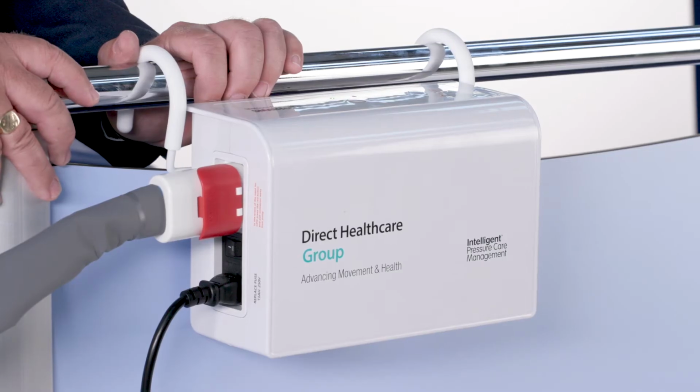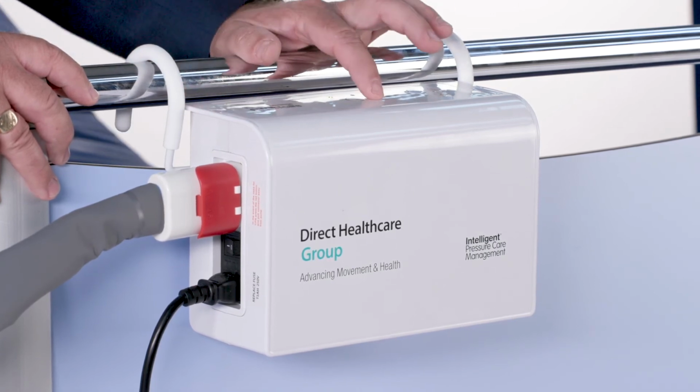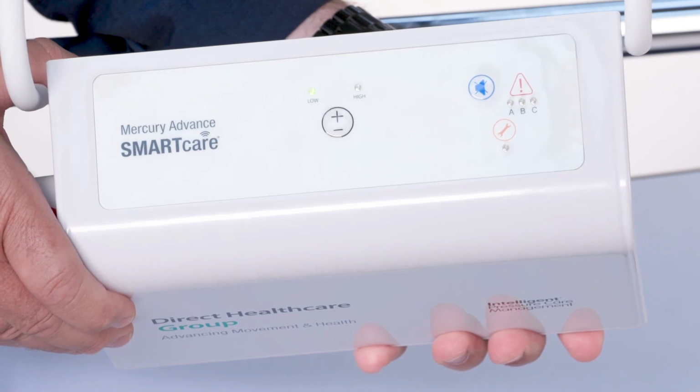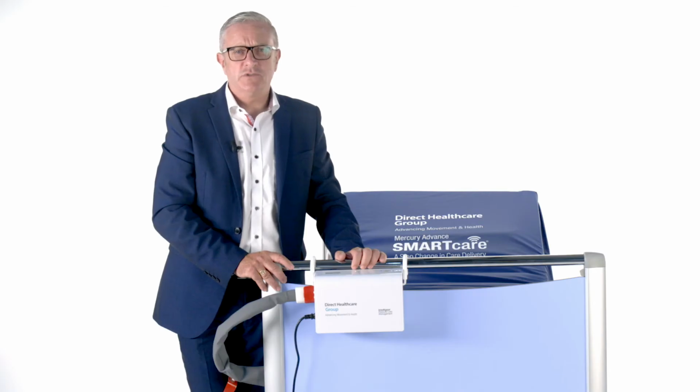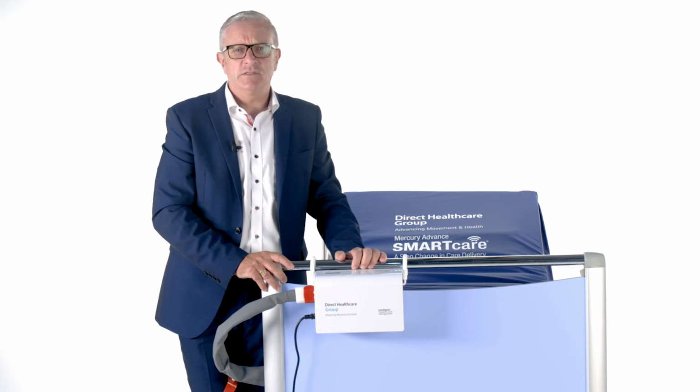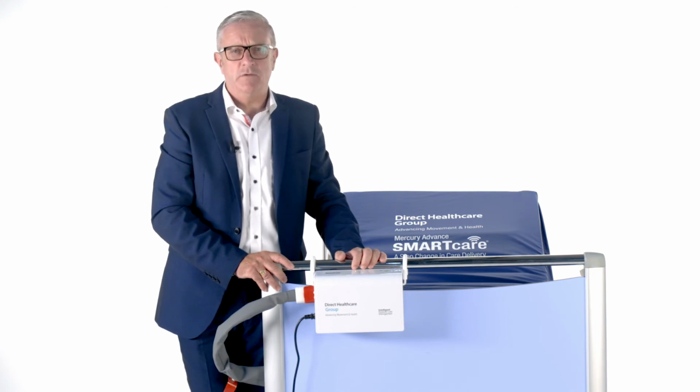To change the pump to the high setting, press the high-low plus or minus button. The high setting light will illuminate. To return to the low setting, press the high-low plus minus button. In the low setting, the cells are at 18 millimeters of mercury. In the high setting, the cells are at 26 millimeters of mercury. Whether the patient should be on the high or low setting should be determined by the clinician.